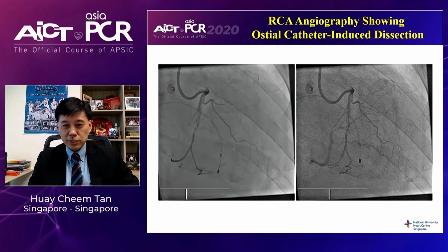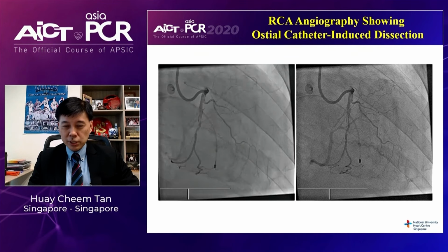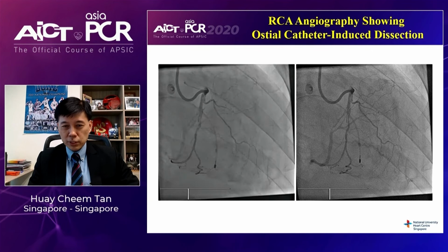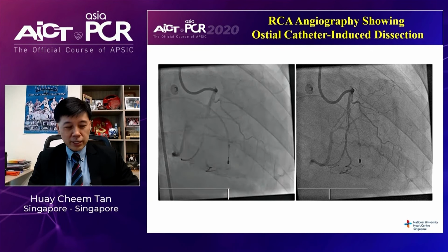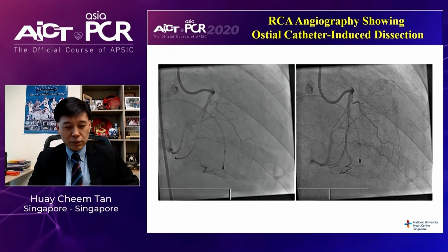So I got a little bit concerned. So I decided that perhaps I wouldn't touch this RCA and try to salvage it for now. I would just go to the LAD and treat the LAD. And if I can get away with a successful LAD, then I might just come back and do this again.